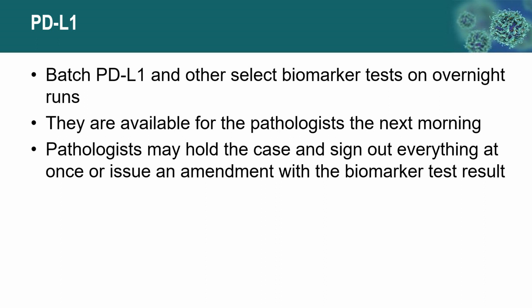And we left it up to our individual pathologist if they would like to hold the case and sign everything at once, or issue an amendment with the biomarker test. We did this in collaboration with our clinical colleagues, and essentially said, what's your expected turnaround time for some of these biomarkers? How long after we make a diagnosis do you need a PD-L1 result? And our oncologists here were very pleased when we said, we'll get you the results in 24 to 48 hours.